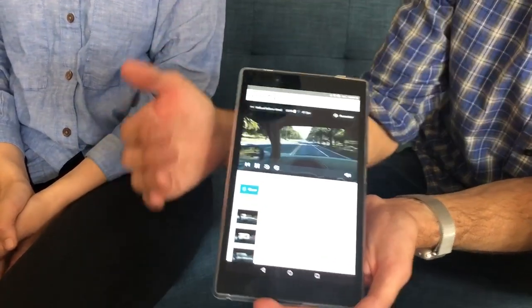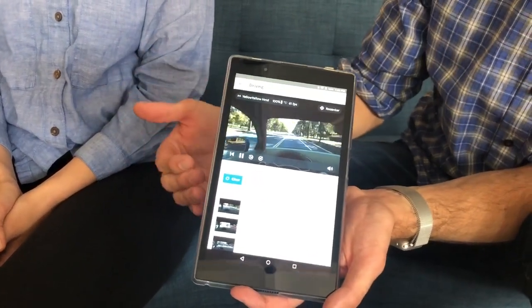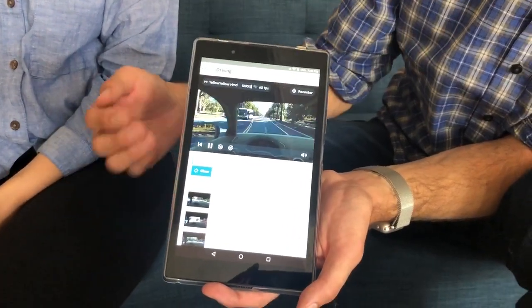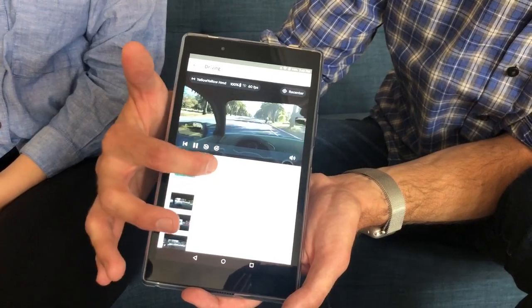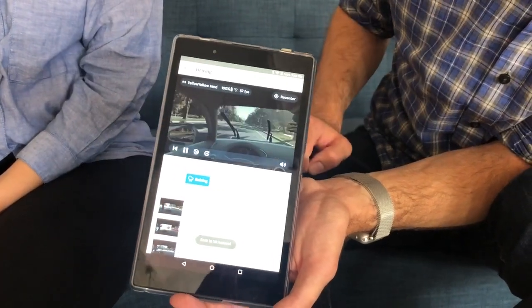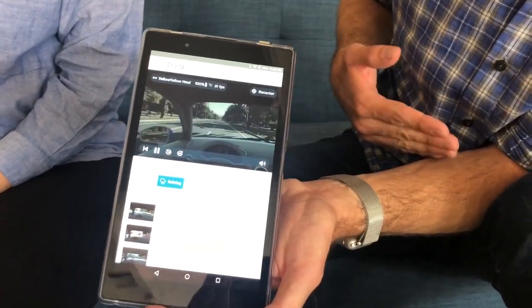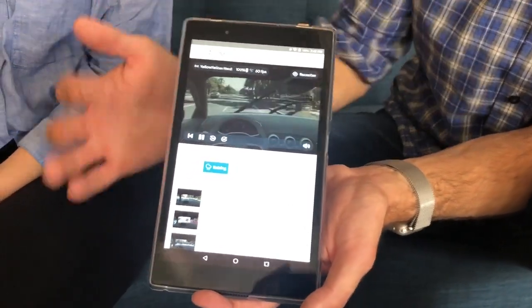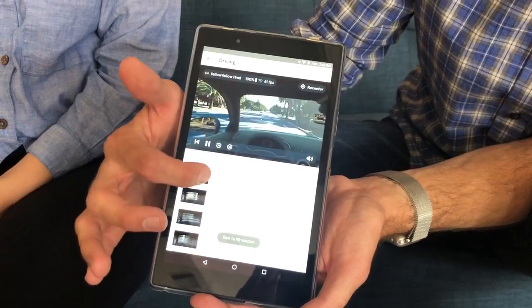And we start out in our exposure hierarchy with a very easy drive. This is a slow drive that she's experiencing. But as a clinician, I can of course adjust this virtual environment. I can make it rain by clicking that button, and now it's raining. And in fact, I don't know if the camera can fully pick it up, but you can hear the rain on the windshield. And this is just some examples of my controlling the virtual world.